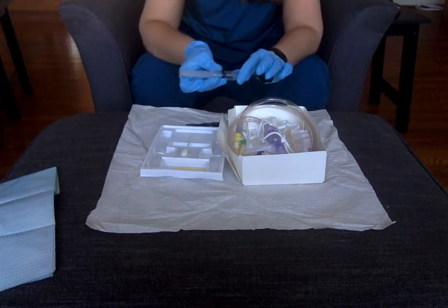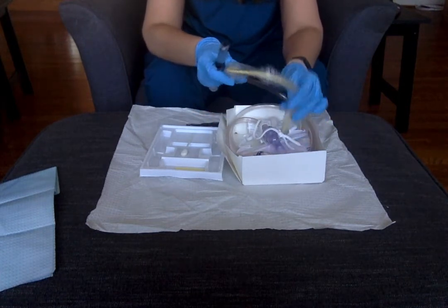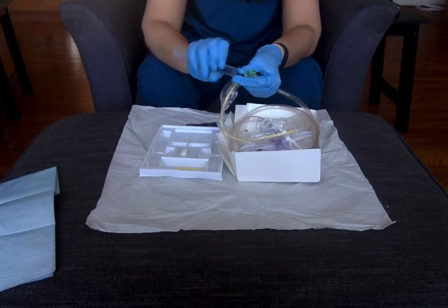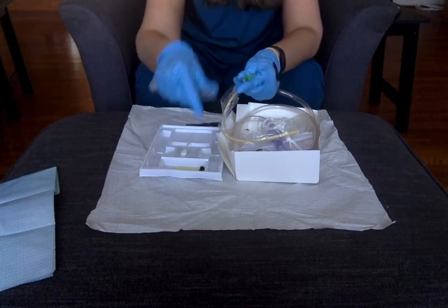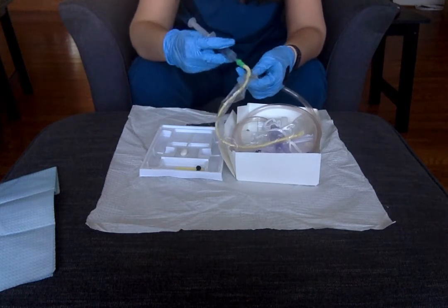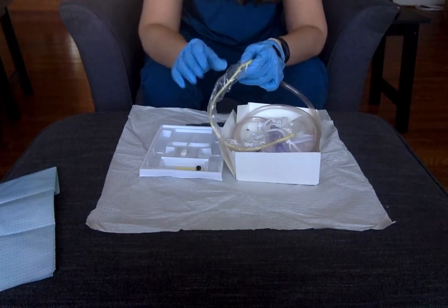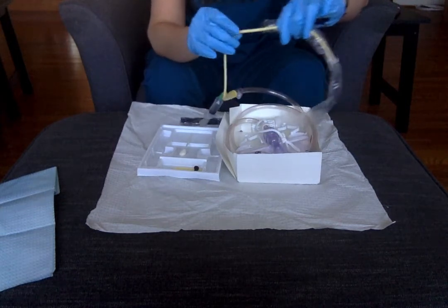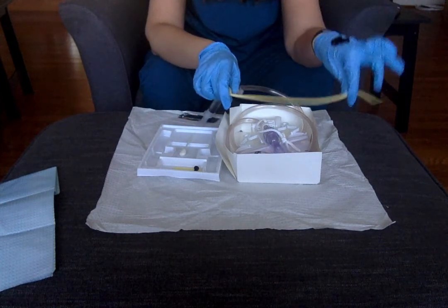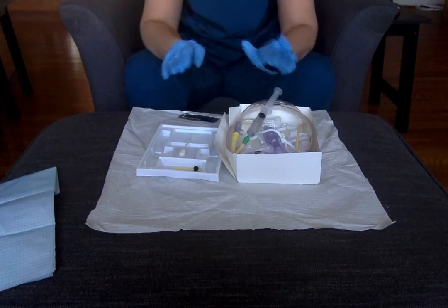You've also got a syringe with some sterile water or saline in it, and this is to attach to your catheter onto this port here. I'm going to go ahead and attach this — this is what's going to inflate my balloon. It has 10 milliliters of sterile water. It's just the slip tip; you push it right in. The last thing I need to do is take this plastic covering off — it's much easier to do while you have two good hands. I'm going to slide this off and make sure I don't lose control of the end of the catheter, because if it flops outside of your sterile field, you've got to start all over again. I'm sterile right now and I haven't touched anything else.